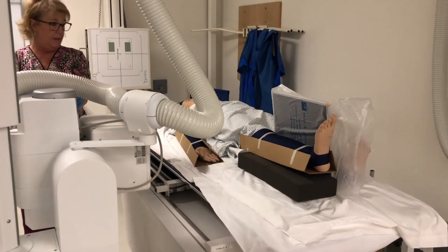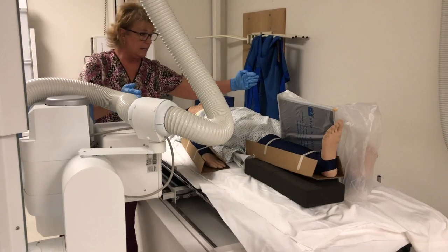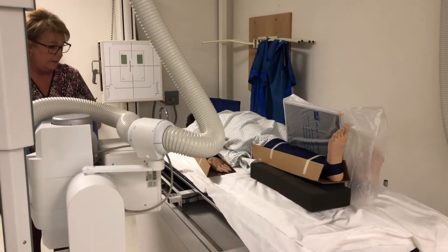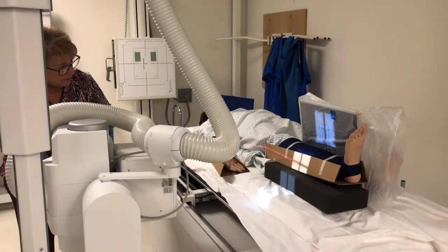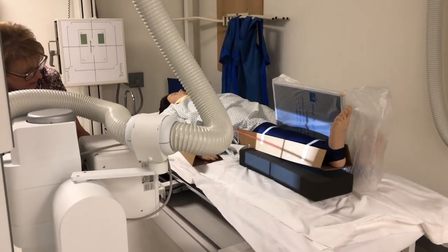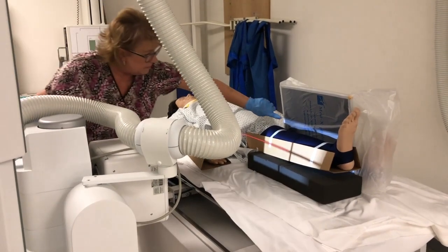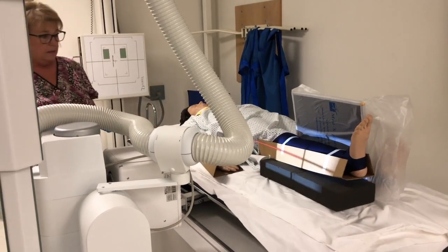I'm going to angle this a little bit because the cassette was turned, so I want to be perpendicular to it. And center to the leg and to the center of the IR. Change my collimation. Okay, I would place my right marker inside the field of view and expose.